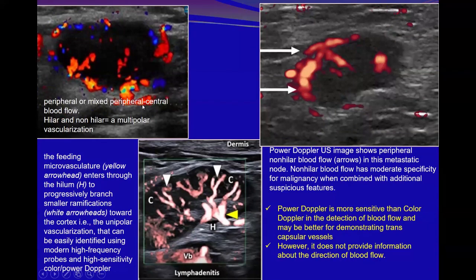Okay, we have seen this just now. And look at this one. Here we can see two colors or more than one color, so we are dealing with color Doppler. And here I can see this is again a lymph node, but this is a single color, so here I am dealing with power Doppler, demonstrating extensive peripheral vascularity. This is capsular. When I see this sign in a breast lesion, it is a reassuring sign. But this sign in a lymph node is the reverse, a highly suspicious sign, especially with this hyperemia. Okay, it is highly suggestive of malignancy, metastatic lymph node.